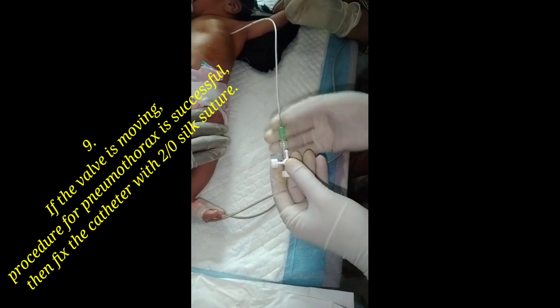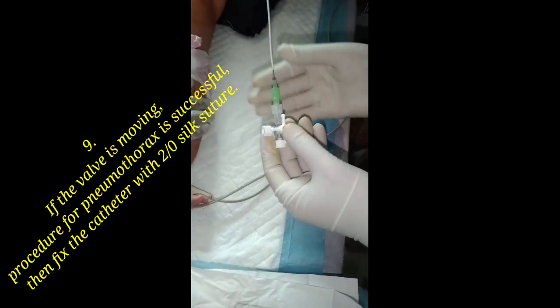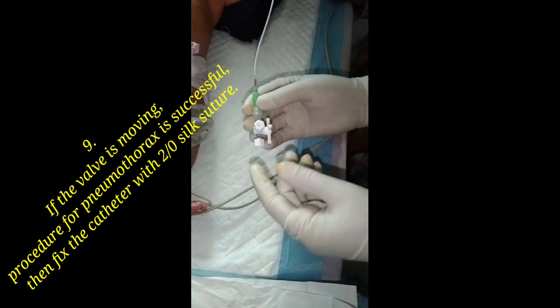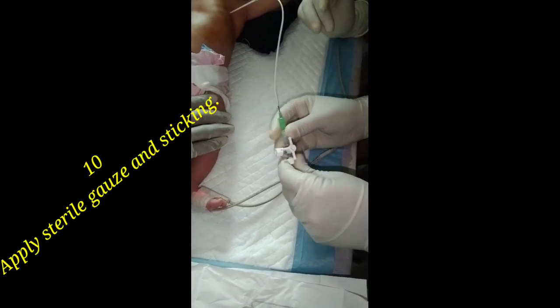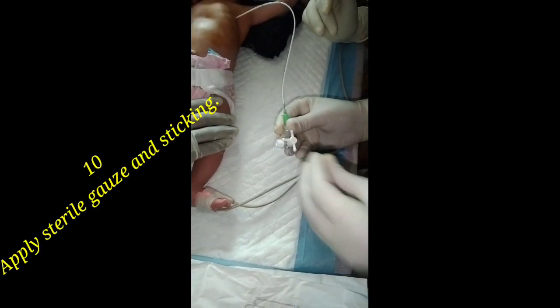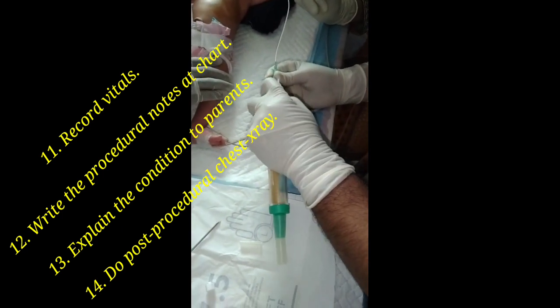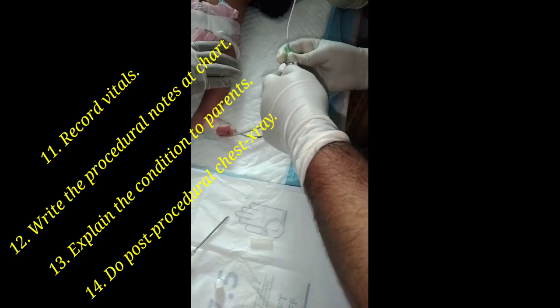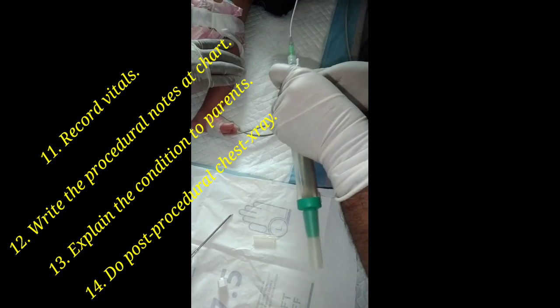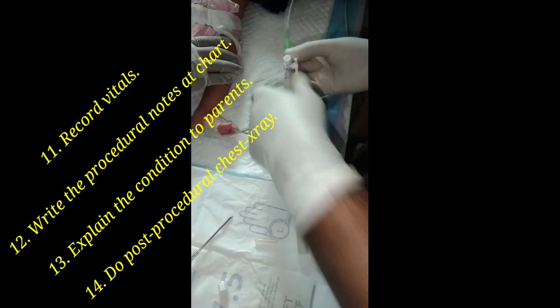Ninth: if the valve is moving, the procedure for pneumothorax is successful. Then fix the catheter with 2-0 silk suture. Tenth: apply sterile gauze and sticking. Eleventh: record vitals, write the procedure notes in the chart, explain the condition to parents, and do a post-procedural chest X-ray.